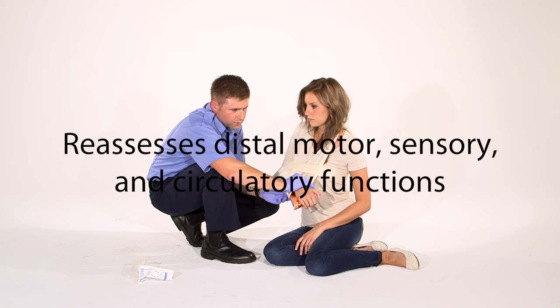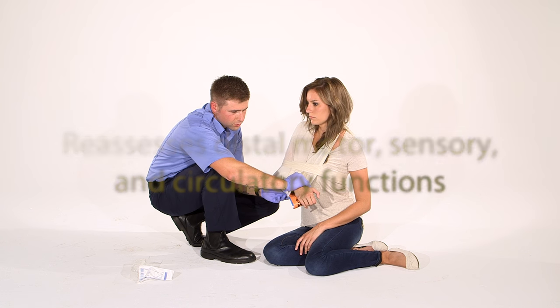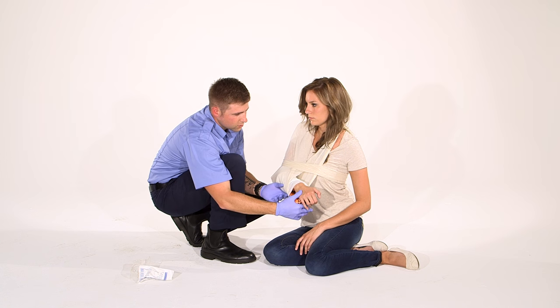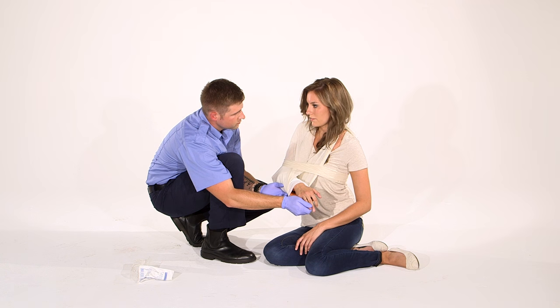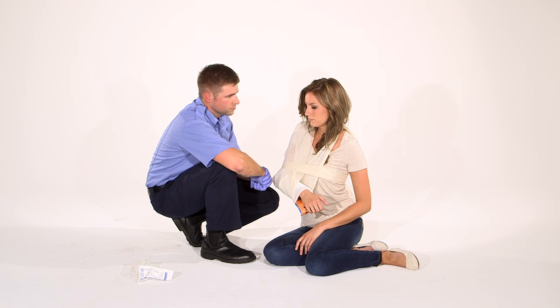I'm going to reevaluate CMS. All right, we've got a pulse. Can you squeeze your fingers? Okay, excellent. Motor, sensory, and circulatory functions are present and normal.